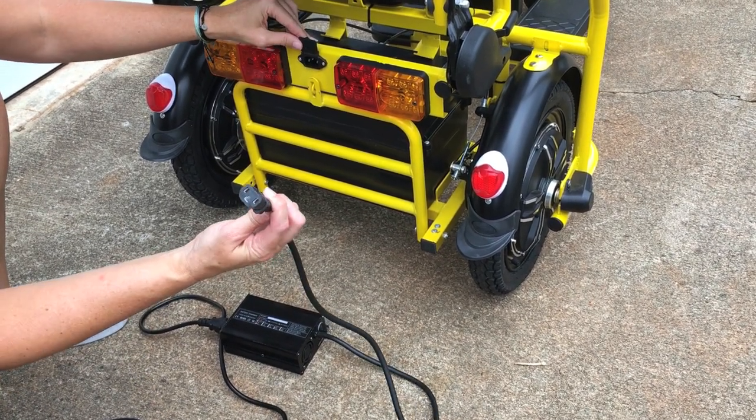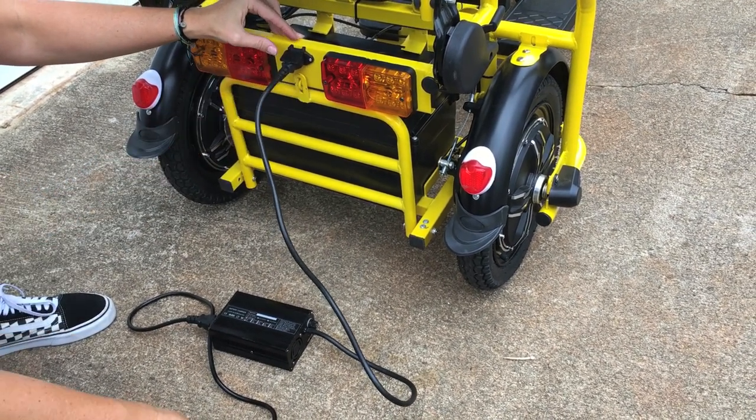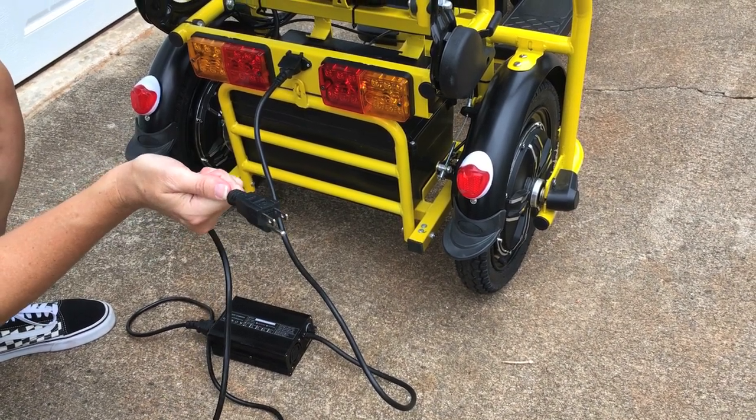lift the flap, insert this end into your flyer, make sure you have a good connection, then take this end and plug it into a regular 110 outlet.